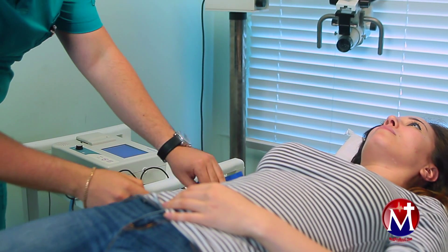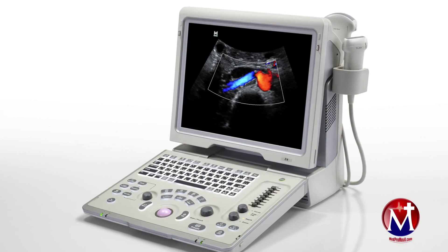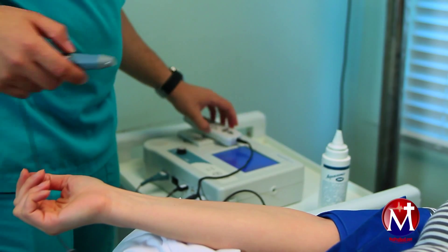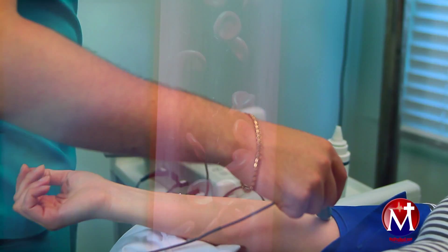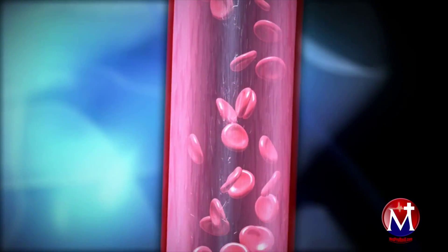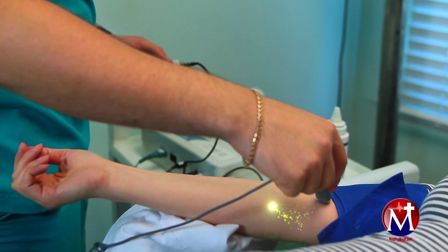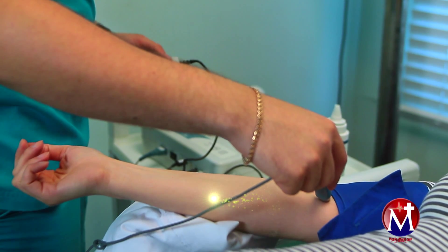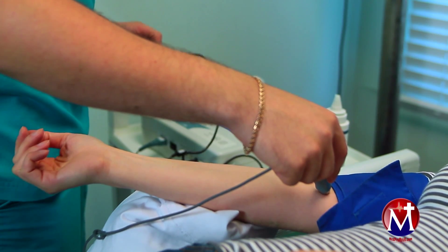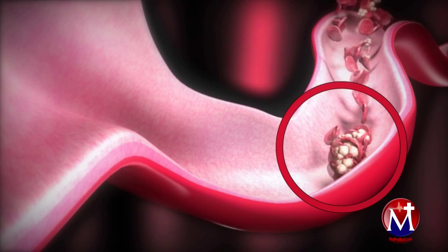The ankle brachial index, or ABI, uses a Doppler device — which Eugene just placed on this patient's arm — to detect the blood flow within the ankle and the arm. The two results are then compared, and that will allow a proper assessment of a patient's risk. Blood pressure that is lower in the leg than in the arm may be a sign of a blocked artery.